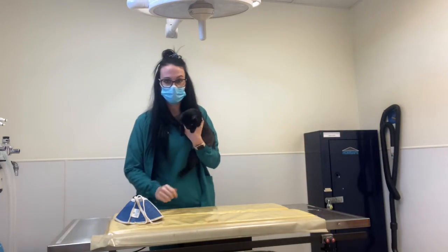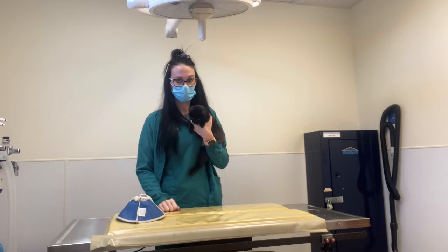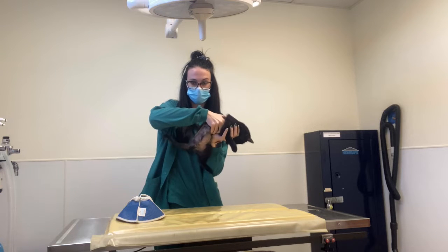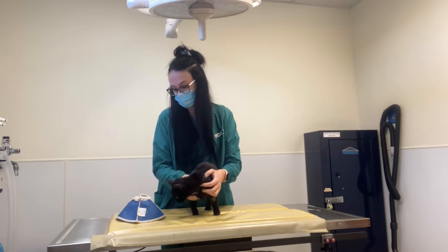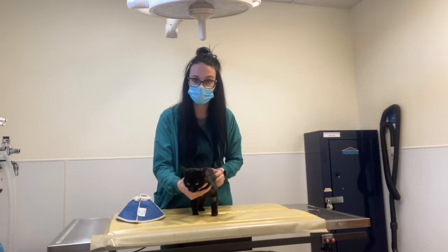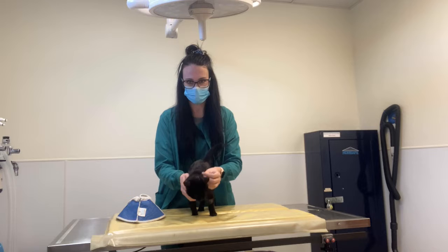Okay, so again, this is Venus. We are going to put her e-collar on her. Like I said, she had a right rear leg amputation, so she's needed an e-collar. She's about 3 weeks post-op, so she's been really good about not messing with her incision when she's supervised and stuff like that, so she hasn't had to wear it, but for the video today, she does.